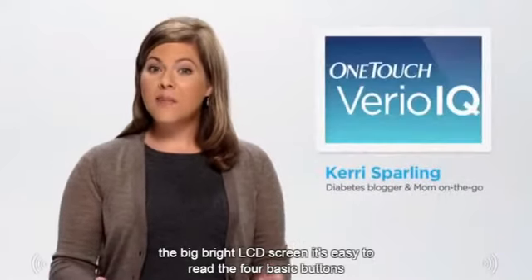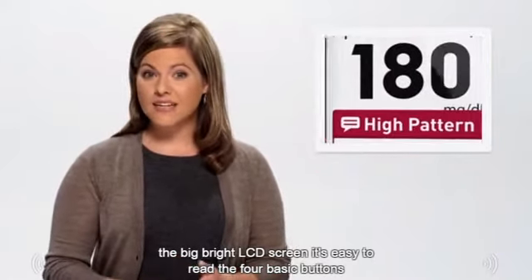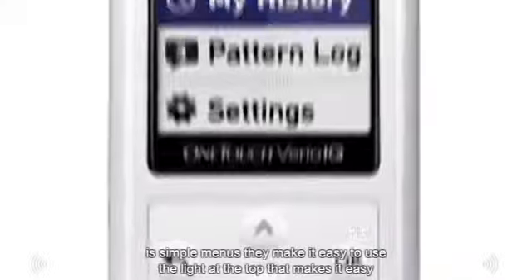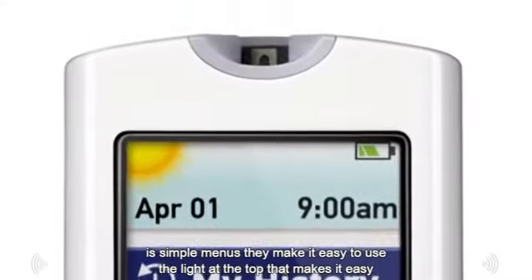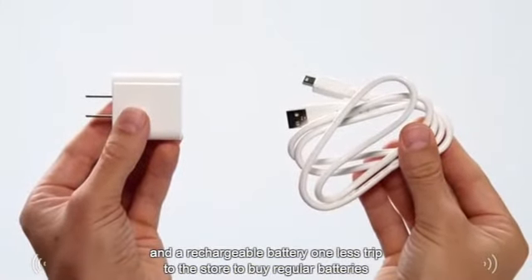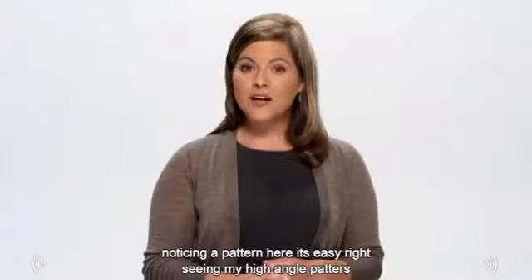Some of my favorite features are the big bright LCD screen that's easy to read, the four basic buttons and simple menus that make it easy to use, the light at the top that makes it easy to test in the middle of the night, and the rechargeable battery — one less trip to the store to buy regular batteries.